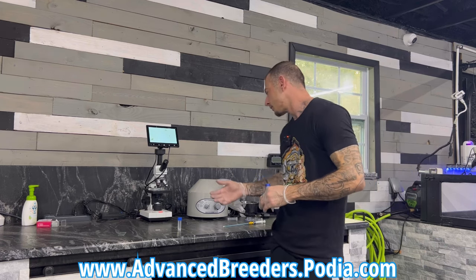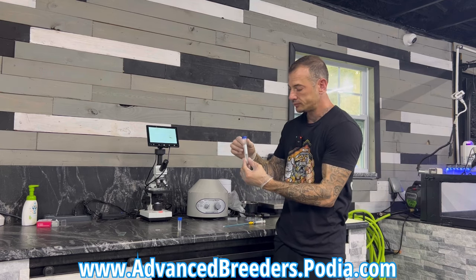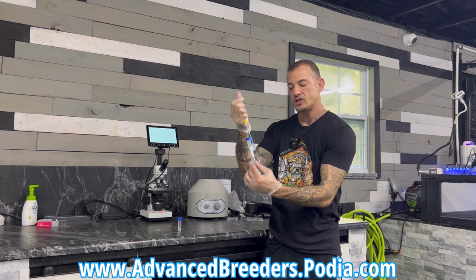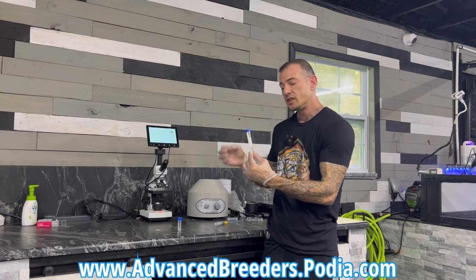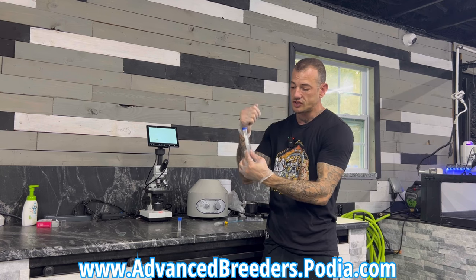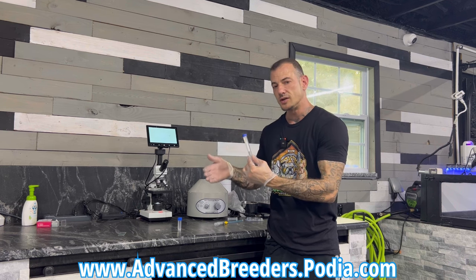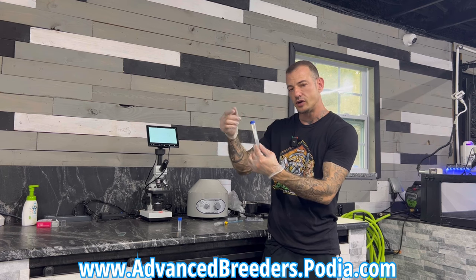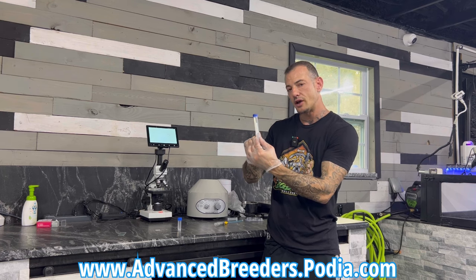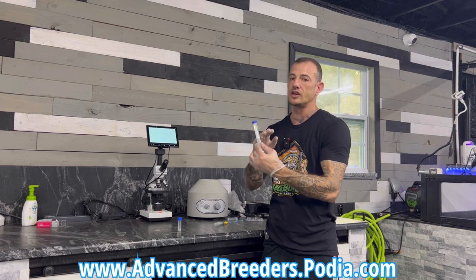Also, if you're shipping out semen and you want to be the best stud owner and give the best service possible, it's best to do your collection, spin down your sample, get your pellet, then take all the prostatic fluid out — suck it out off the top. Then take your semen extender and add however much for your collection. It's a ratio you use with the semen extender, so how much you put in depends on how much your collection was. Pull that prostatic fluid off the top, leave your pellet with a small amount of prostatic fluid if any, add your extender, then ship it out — and your sample is going to do much better that way.